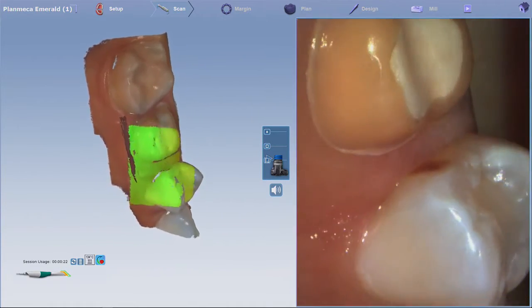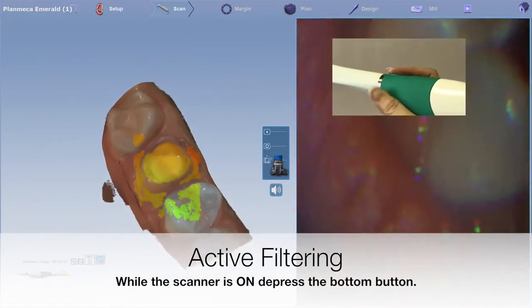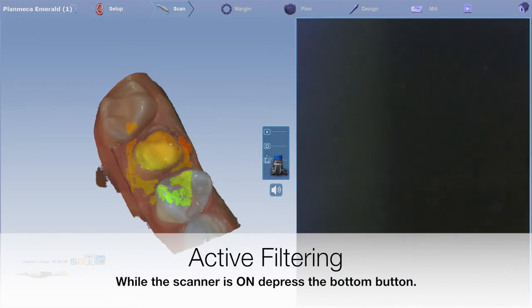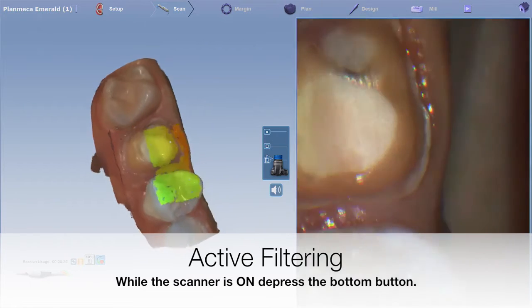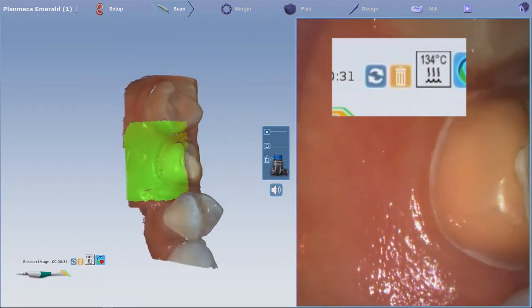While the scanner is active, it's easy to turn on active filtering. Depress the bottom button on the scanner, then hover over the area to remove the unwanted information. You can identify active filtering by the trash can above the scanner icon.